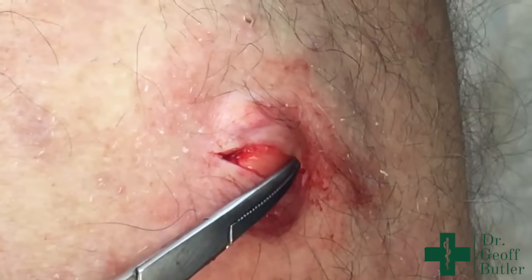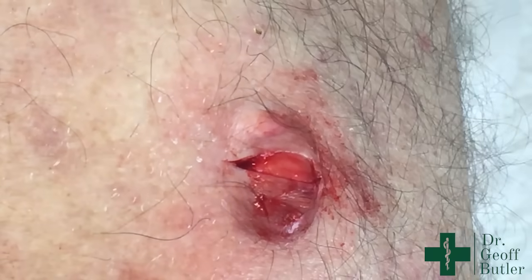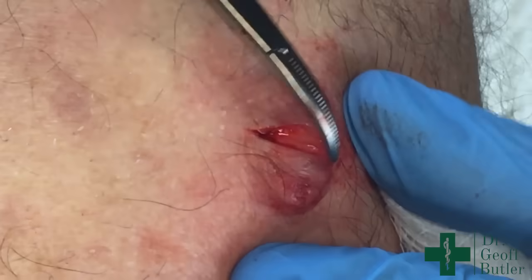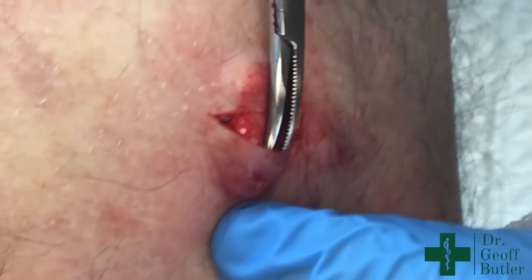If this does rupture, it's not a big issue. I would tell you that pilar cysts are notoriously simpler to get out entirely intact. Epidermal cysts are a little bit more of a challenge.